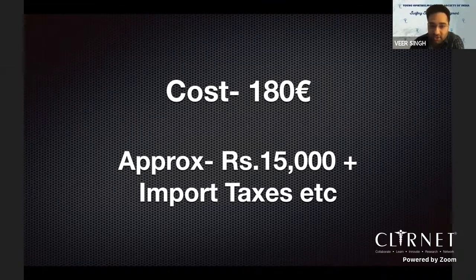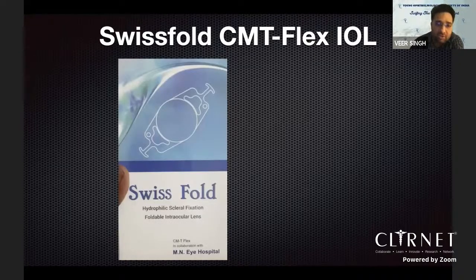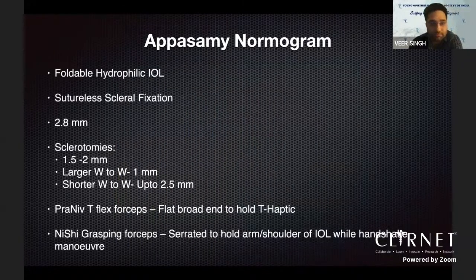So my wait continued, and then finally the day came when Appasamy launched the Swiss Fold CMT T-Flex IOL, which was a single piece hydrophilic scleral fixated IOL, which was designed by Dr. Navian at MNI Hospital. This is what it looked like. It comes with a nomogram supplied by Appasamy. It's a foldable hydrophilic IOL.